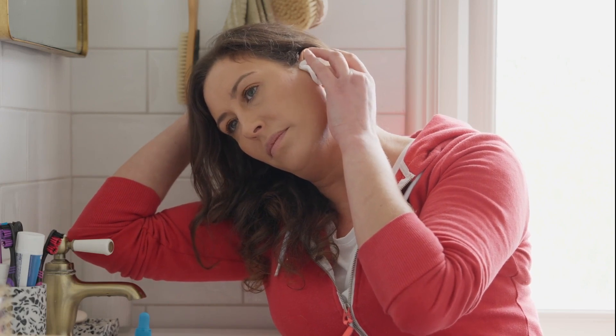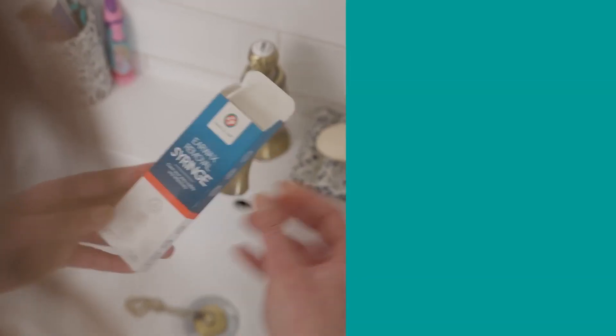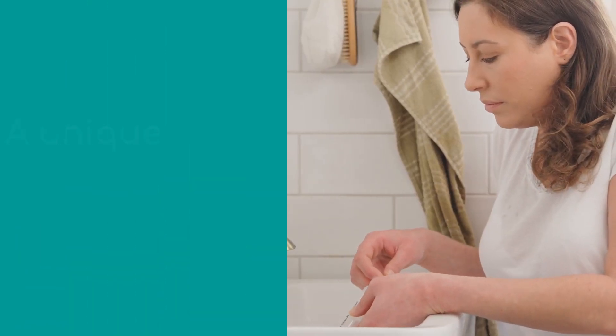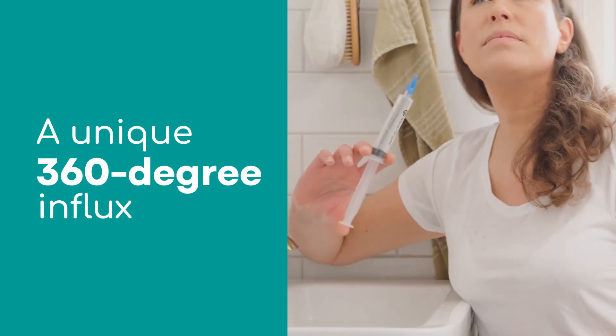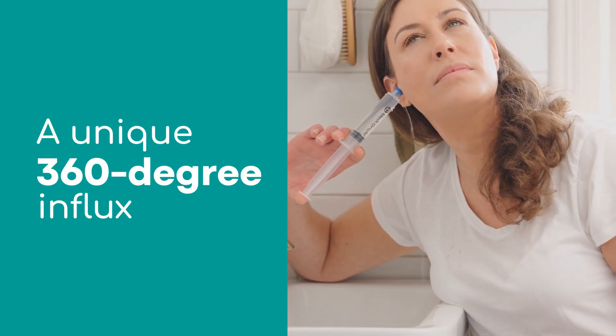Say goodbye to using misleading ear candles, expensive treatments, and harmful cotton buds — with our earwax removal syringe delivering a unique 360-degree influx of pressurised water through an innovative quadstream tip to quickly, safely, and thoroughly clean the ear canal.